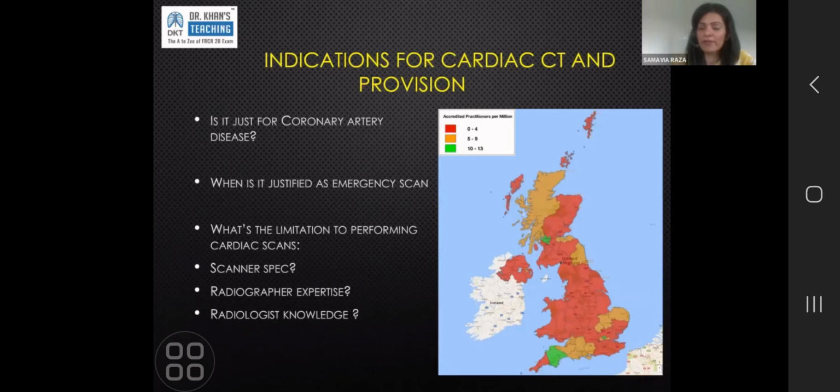A coronary angiogram or invasive angiogram can't give you that answer. It's not safe to. Sometimes cardiologists can accidentally dissect a coronary artery, and then cardiac CT helps to confirm and see how bad it is. That's just for coronary arteries. That doesn't even begin to talk about the congenital abnormalities, the abnormalities of course and origin, pre-transplant, post-transplant.